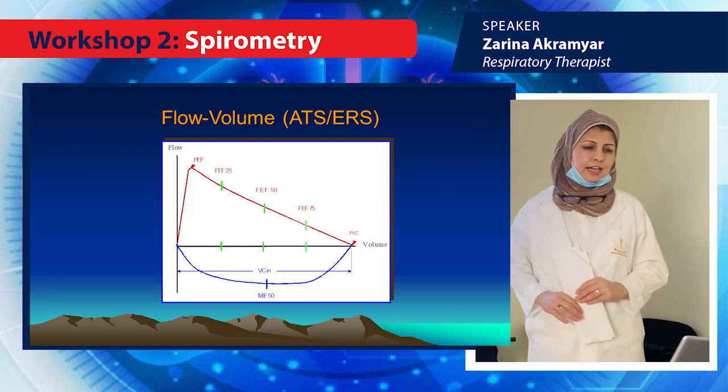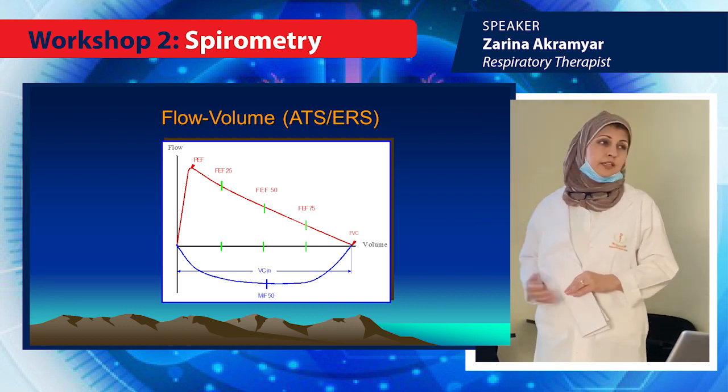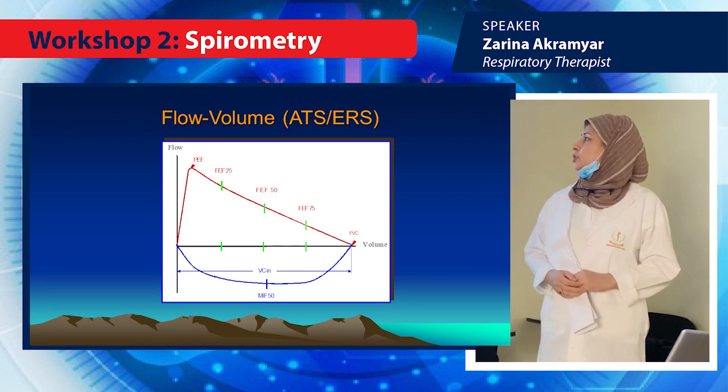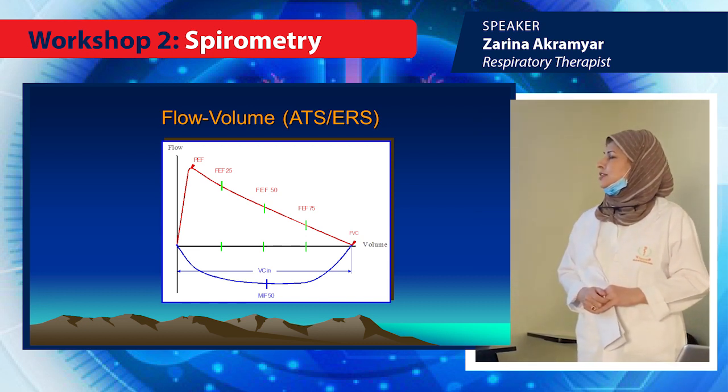This is the graph after the maneuver. Once we do the test, this is what we see on the screen. The red part is the exhalation part, and the blue part is the inhalation.